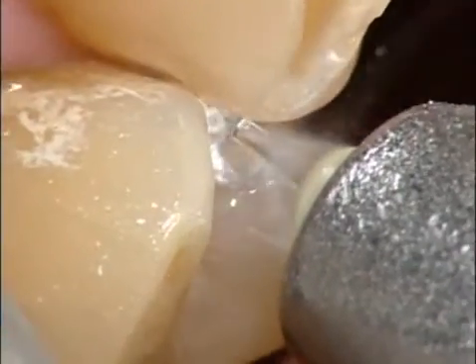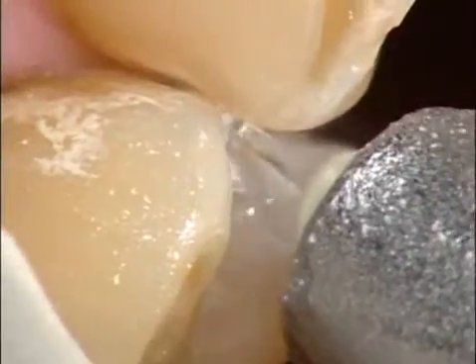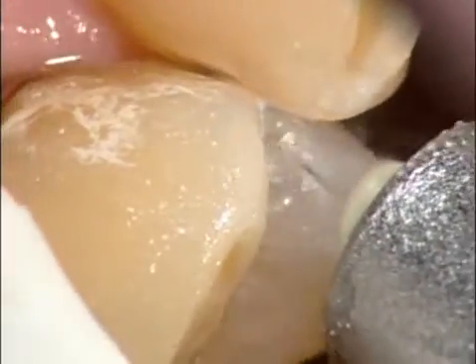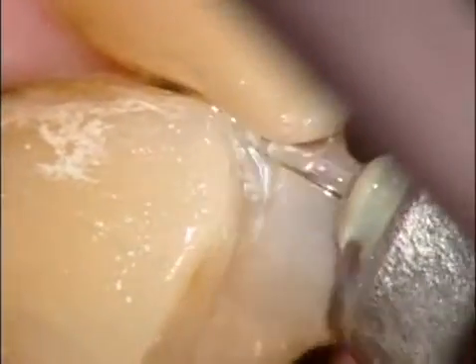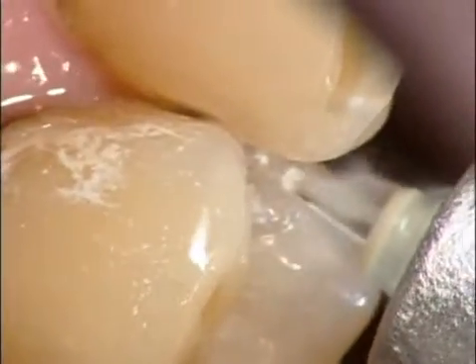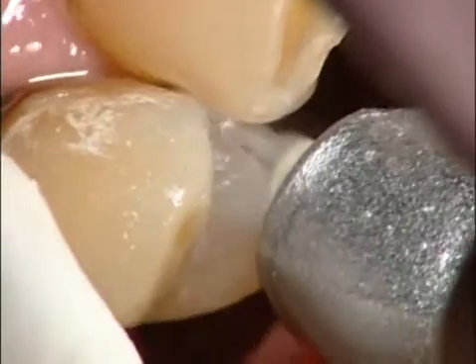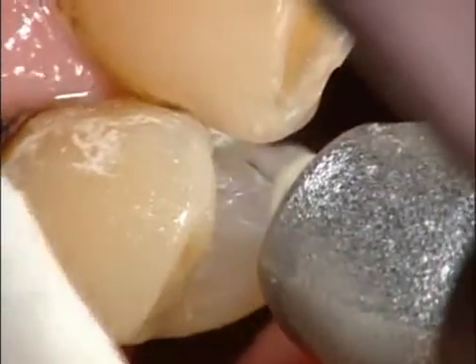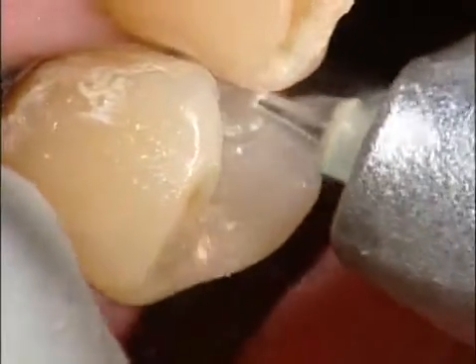If you start right on the thin enamel on the marginal ridge, you'll find that you can do your interproximal reduction rapidly, and then again come as perpendicular as possible to the buccal and lingual surfaces, working the enamel down into the dentin. Once you're into the dentin, go back to parallel and you can remove the dentin and decay with relative ease.